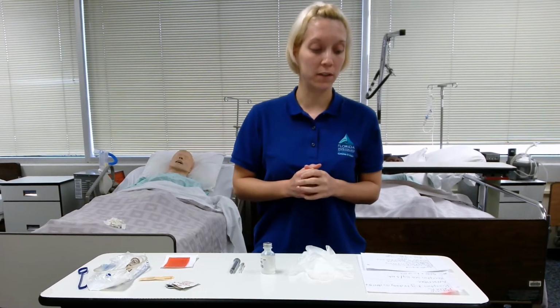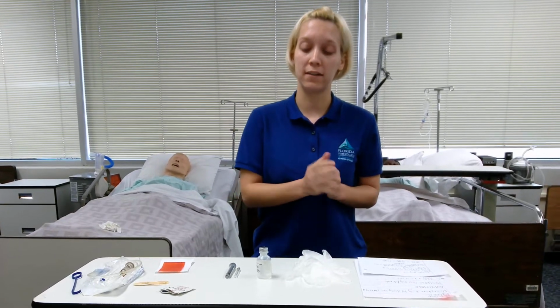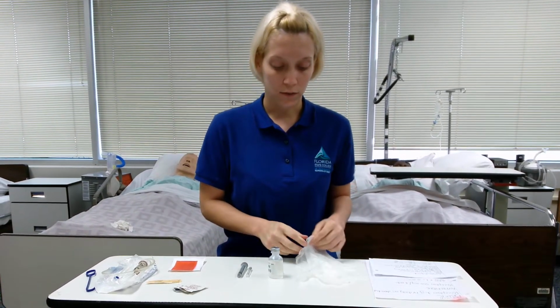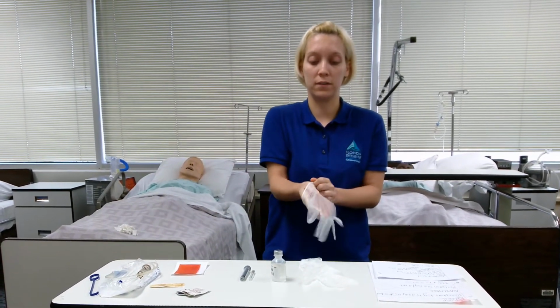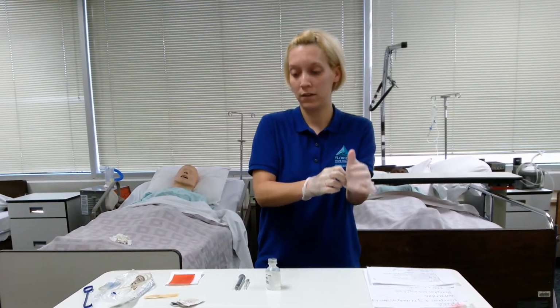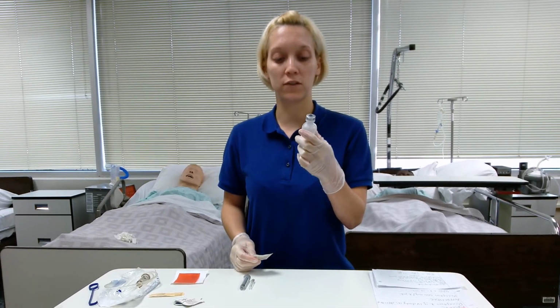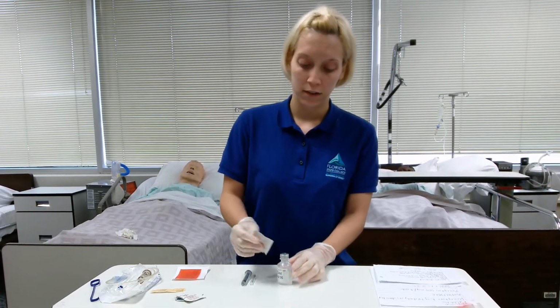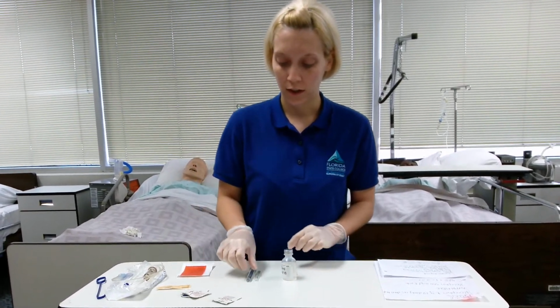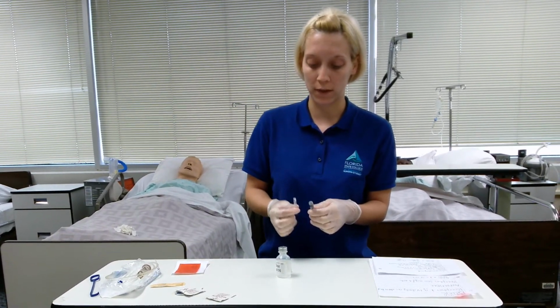Okay, so now I check the patient's labs and allergies in the chart. I'm going to wash my hands and draw up my medication. So I'm going to put on clean gloves. Checking the integrity again, making sure it's not expired. I'm going to use aseptic technique, cleaning that. This would be freshly packaged, so I know I need to draw up 2 mLs.